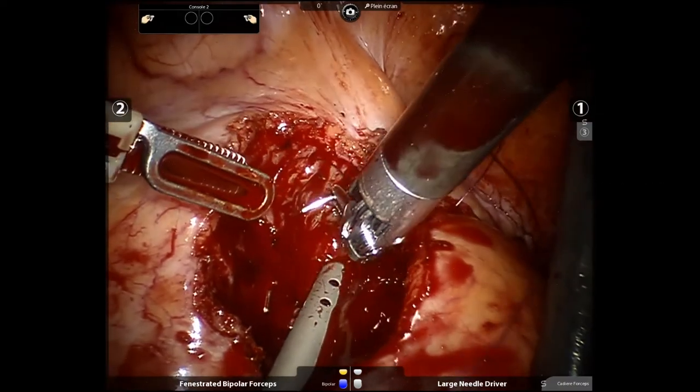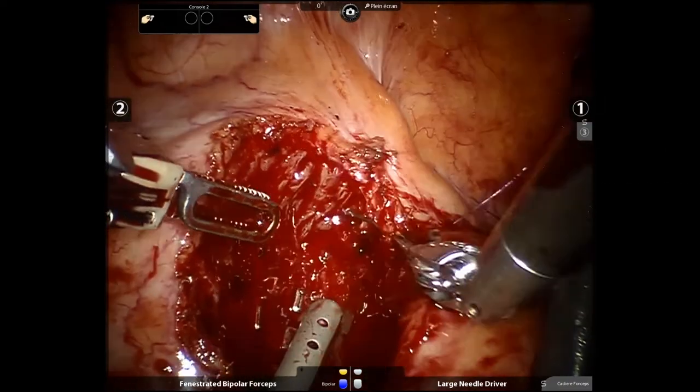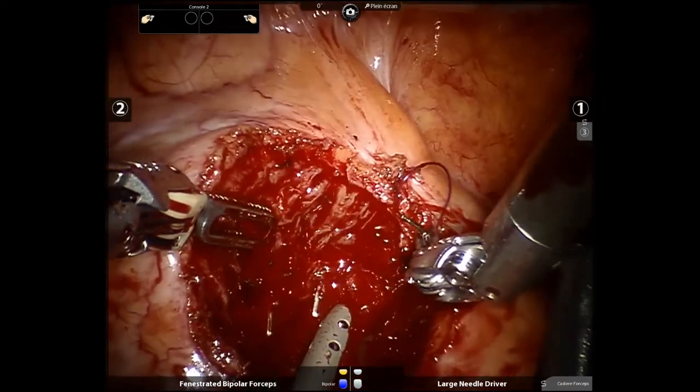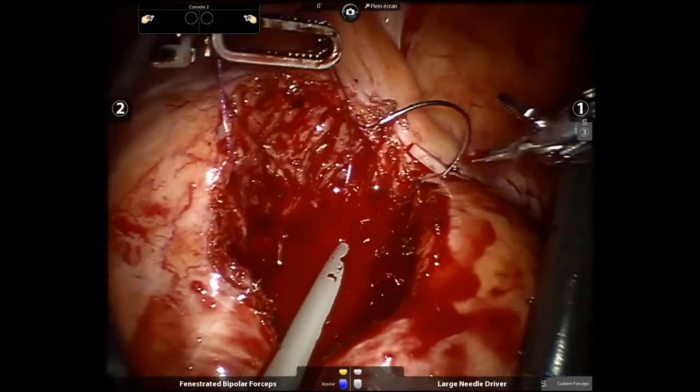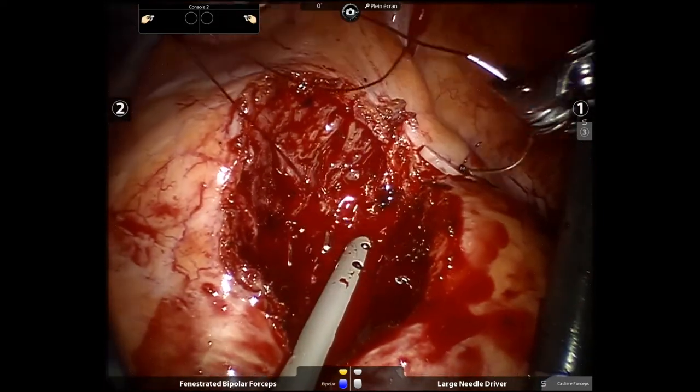After deflation of the occlusive balloon, the segmentary artery vascularizing the graft tumor is sutured.